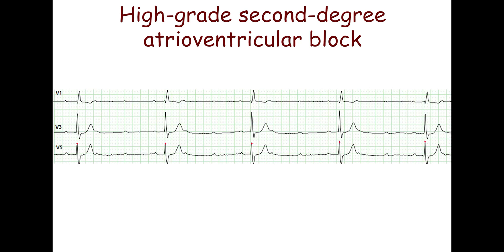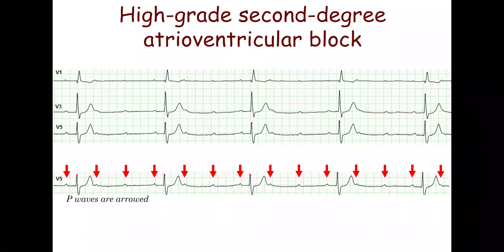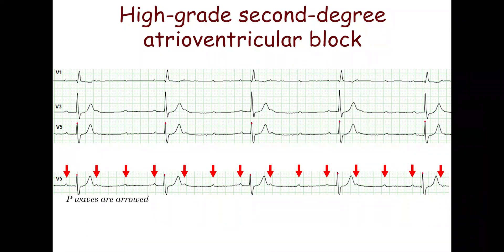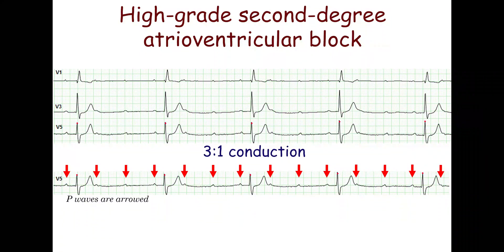A high-grade second-degree atrioventricular block is characterized by a fixed P-to-QRS ratio — 3 to 1, 4 to 1, etc. This ECG shows a ventricular rate of 27 beats per minute with constant PR intervals, and every third P wave is conducted.